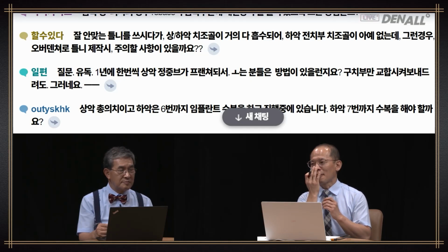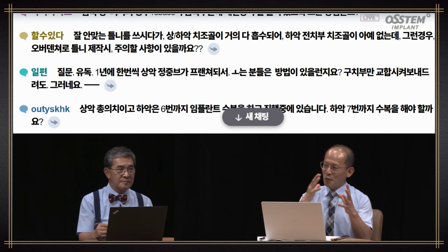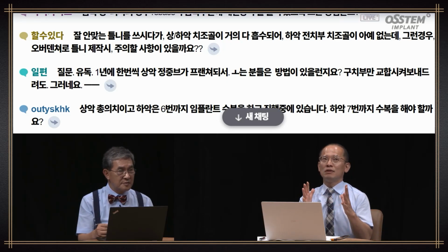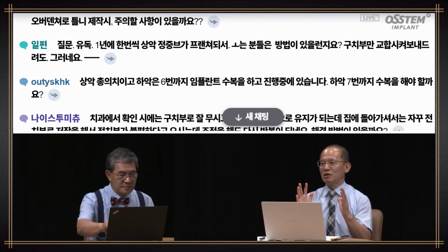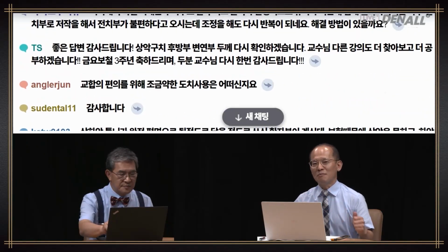and there's a shift in contact on the anterior side, and you have to make adjustments. And the anterior is the only place they want to chew because they have some sensation there, so the denture becomes unstable. Then I have to recover it, so you have to address it again. Hence, nowadays, rather than doing an overdenture with 2 implants, although there's no data available, 2 implants for surveyed crowns, a class 1 RPD.